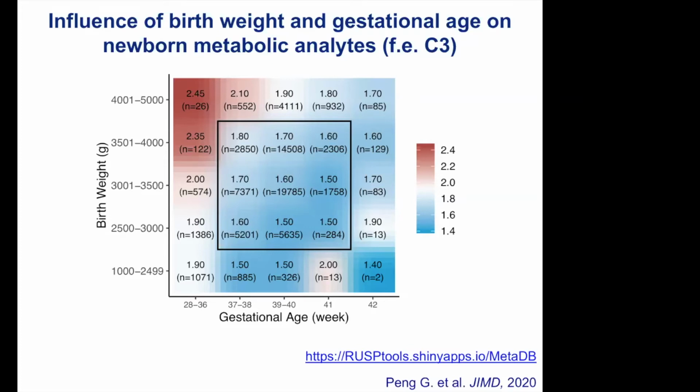As you can see, the levels of these markers are quite different between these different groups. So there is a confounding effect of marker levels in dependence of birth weight and gestational age. Plots for other newborn screening metabolic analytes are available at the web address listed below.